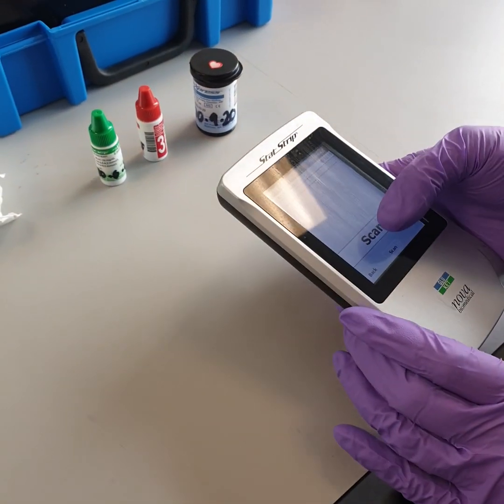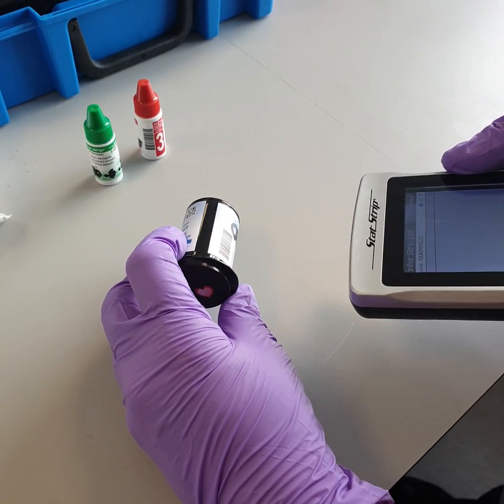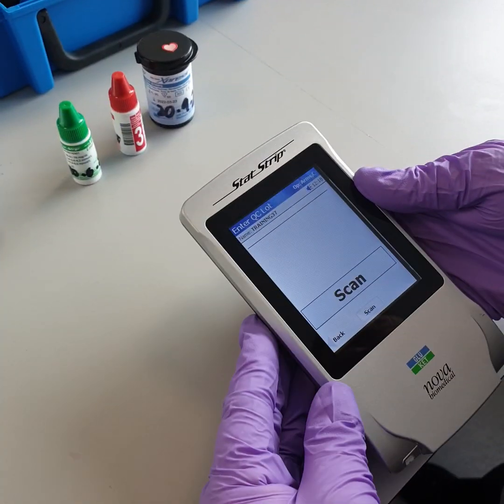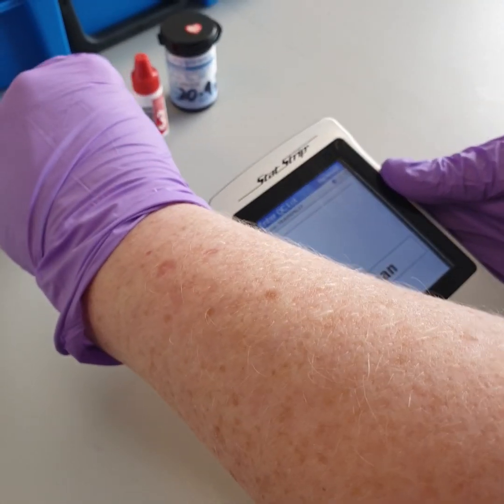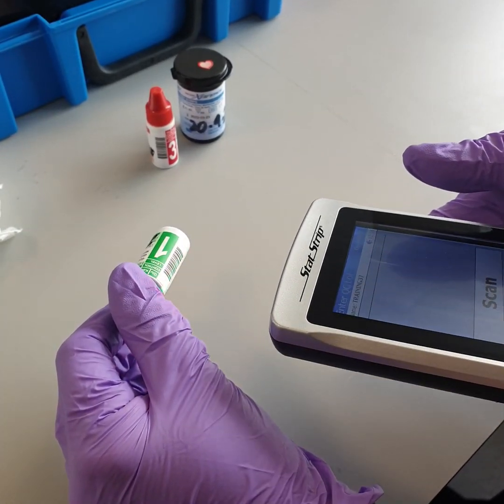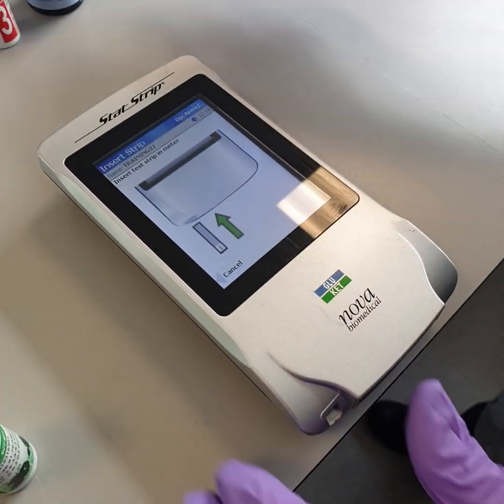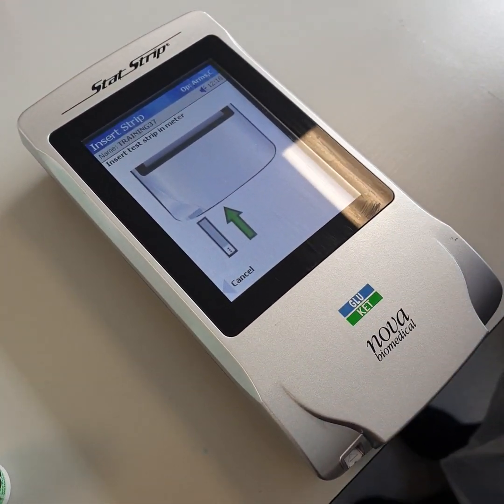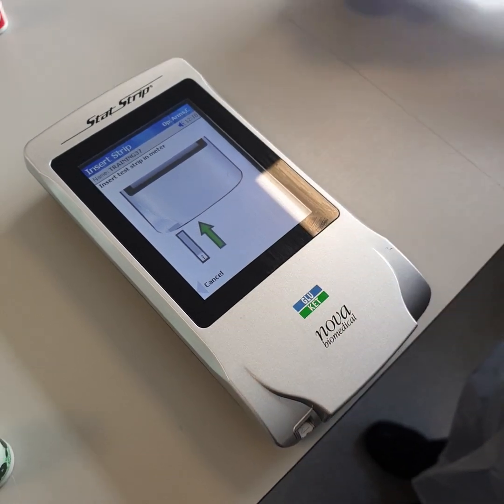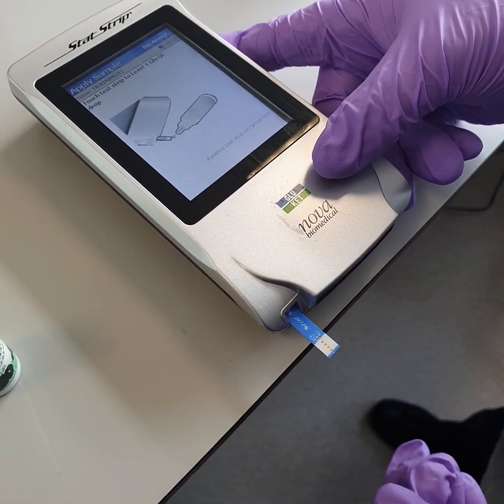Enter the strip lot by scanning the barcode on the strips pot. Enter the QC lot by scanning the barcode on the QC bottle. Insert the strip the correct way — the chip goes into the port. The meter has to be placed on a flat surface.